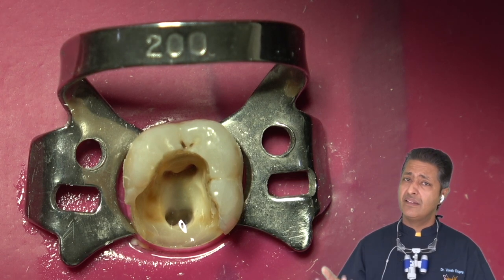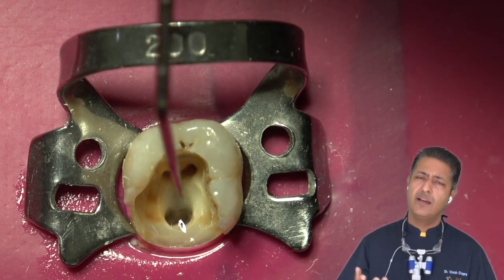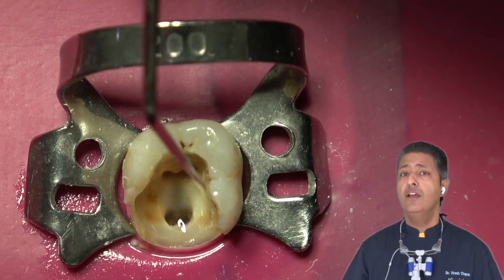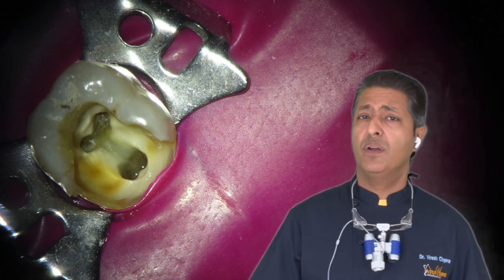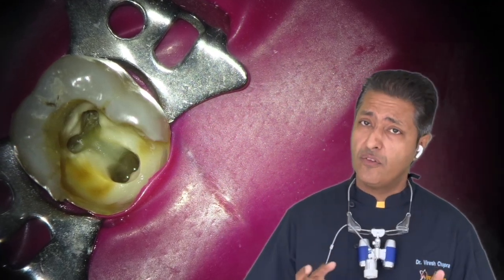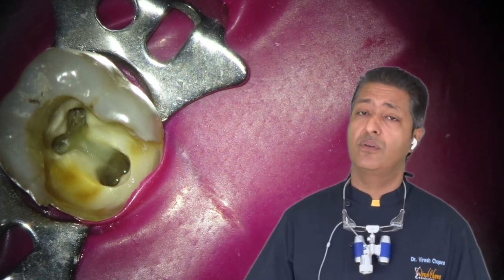Once the canal patency is checked, we are ready to go for working length determination, cleaning and shaping, and subsequently successful obturation. So with this, we come to an end of this video where we have seen how to make a straight line access in a mandibular molar. I hope this will help all of us to guide how to make a straight line access cavity in a mandibular molar and clear many doubts.